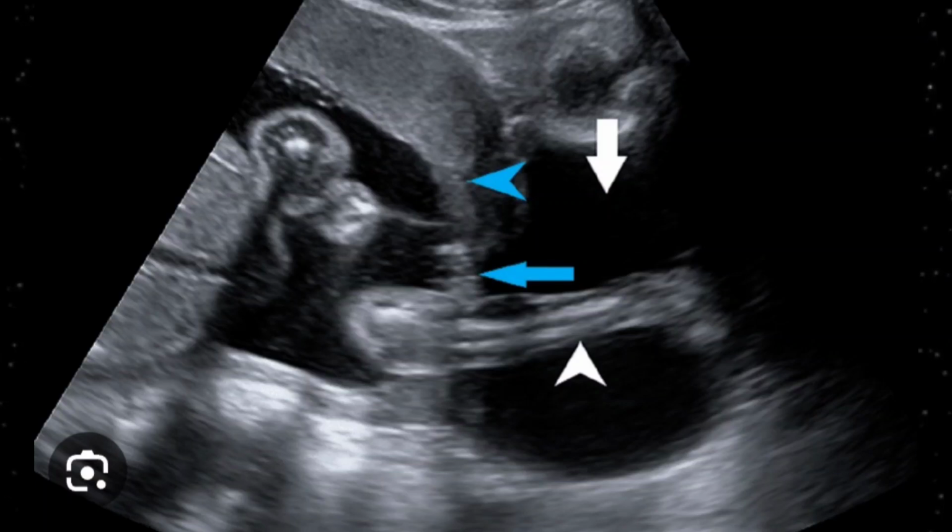So here this image shows clearly that some part of the fetus has been expelled out from the internal os, and it is down into the endocervical canal, and this is an aggressive case of cervical incompetence, and abortion is likely to ensue. Yes, friends, this was all about cervical incompetence.